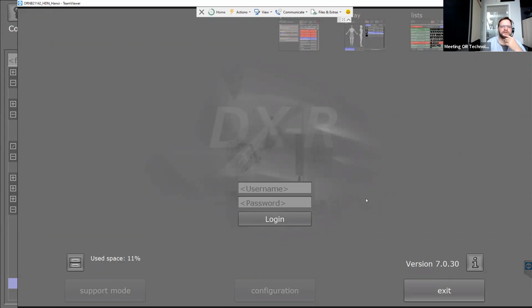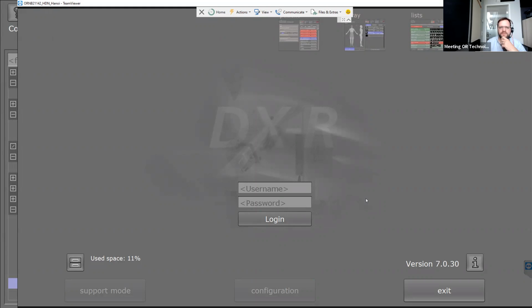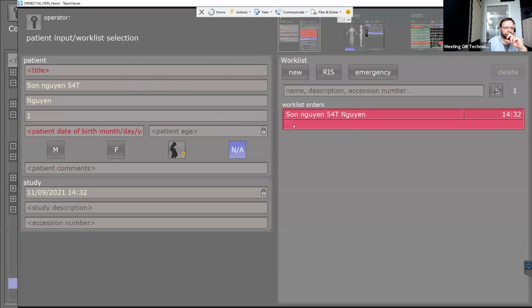So you want to change the patient ID or the name automatically? No, there's no functionality like this in our software. Can you explain in detail the mode, patient ID generate automatically? So I understand it right. It's the patient data, yeah? Like when you set up a patient data here. Do I understand it correctly?